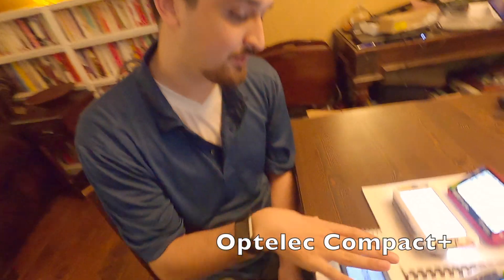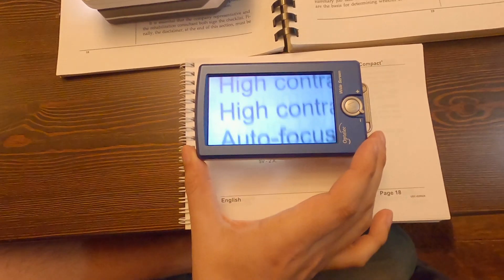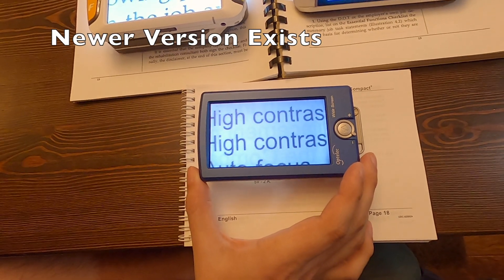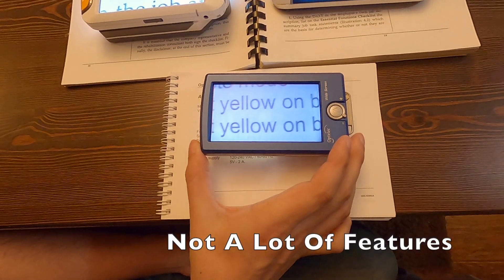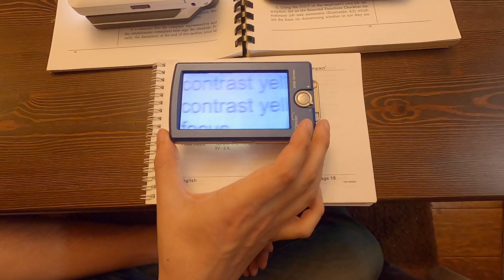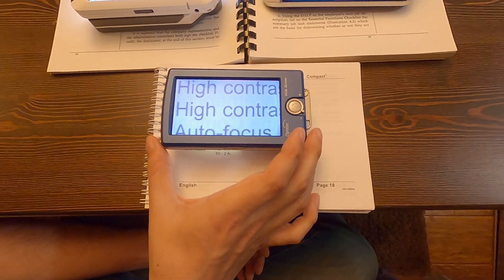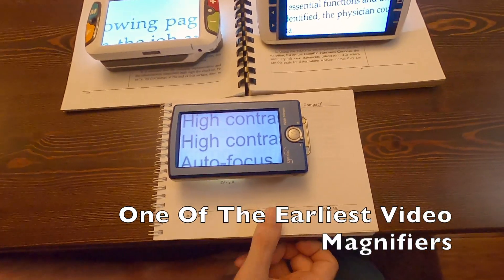So here we have the Compact Plus — there is a newer version of this, this is just the one I happen to have. You can see it's not super crisp, doesn't have a lot of color modes, doesn't have a lot of magnification levels, but this came out in 2007. So this was kind of the first video magnifier that Shender and I have been able to get our hands on.